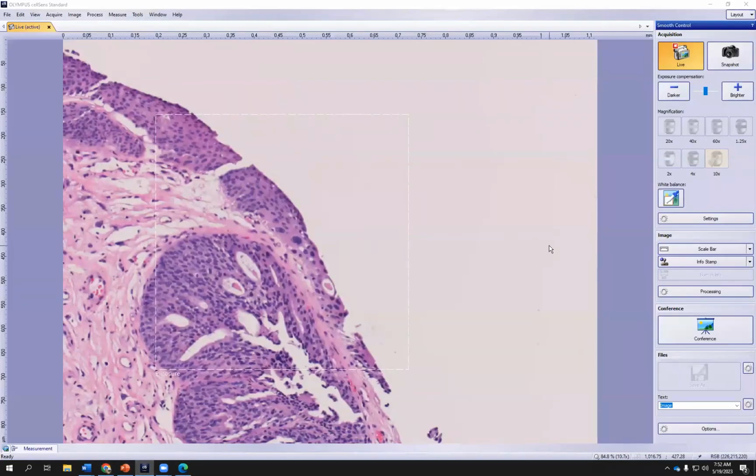So all of you can see the screen, and you can see in the center over here, there are these somewhat larger cells with irregular hyperchromatic looking nucleus and with a pink cytoplasm that look very atypical and suspicious, more so because they are not located at the top and they are located somewhat in the bottom or the center of this cell layer or this urothelial layer.